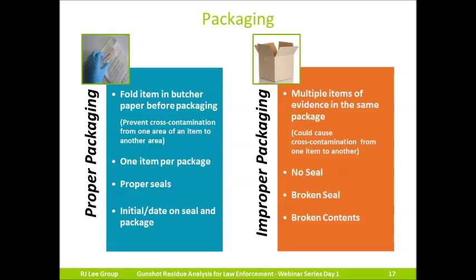Please do not place multiple items from multiple people in one bag. Please remember, the bag should be sealed completely with no rips or voids. Evidence tape should be used with your initials and date on the seal of the package. Please, please do not seal the bags with staples. We will photo document this, and it may come up during discovery.